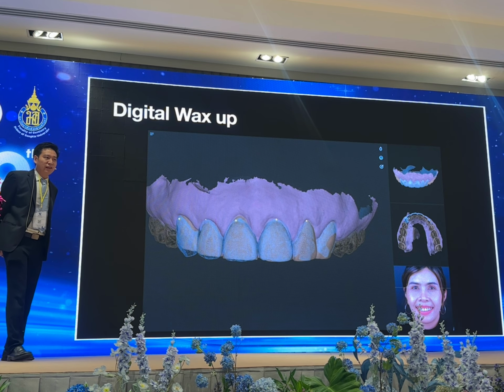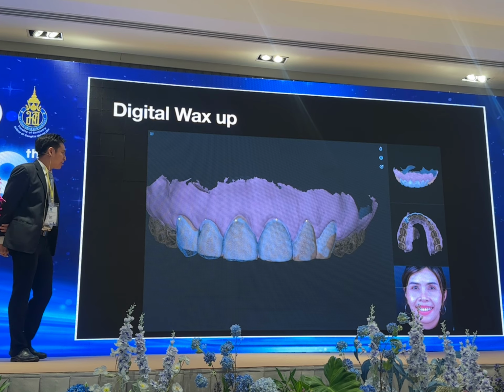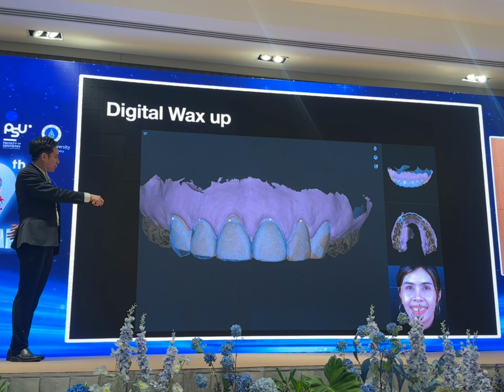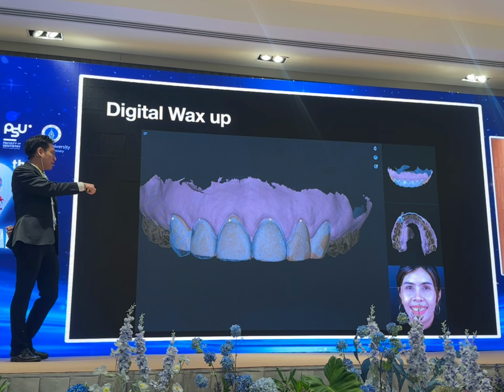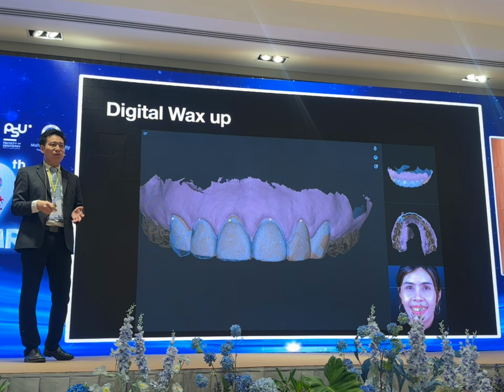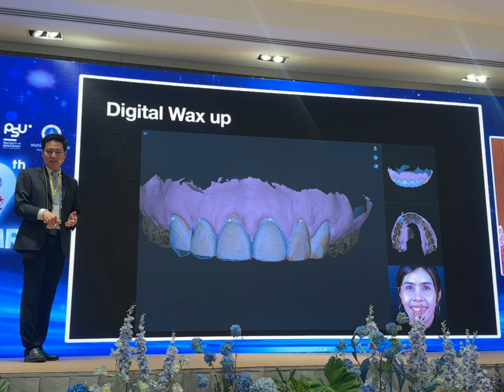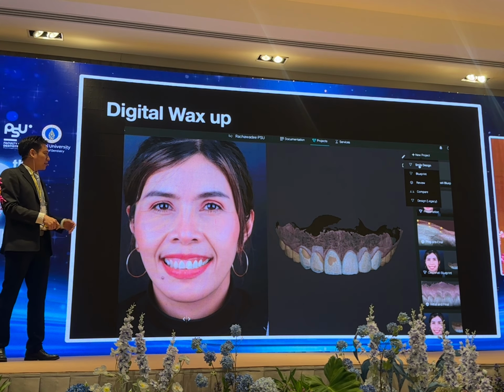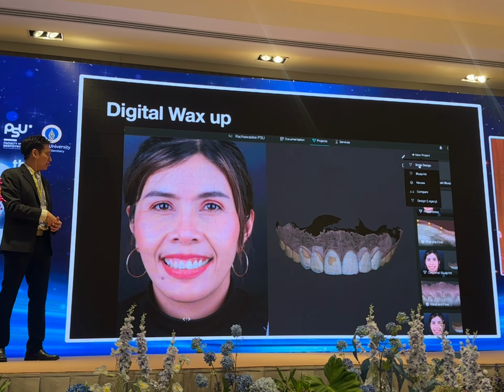With the data we have right now, we notice that the gingiva of the patient has some creeping. We notice that we need to do compensating during the final restoration. So we do digital smile design in 3D. We incorporate every data together.